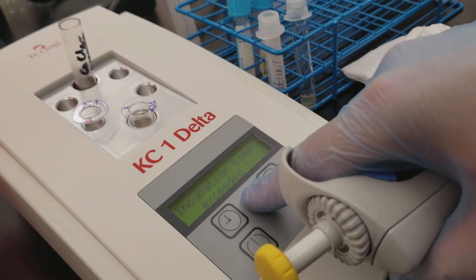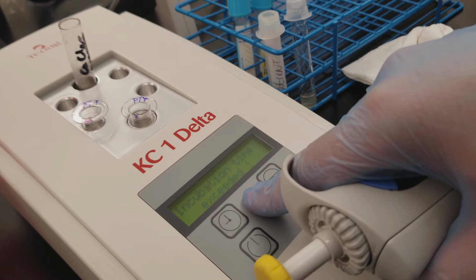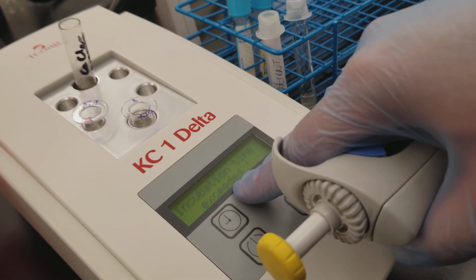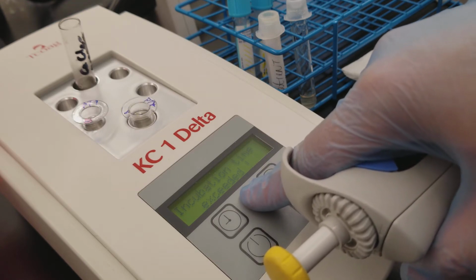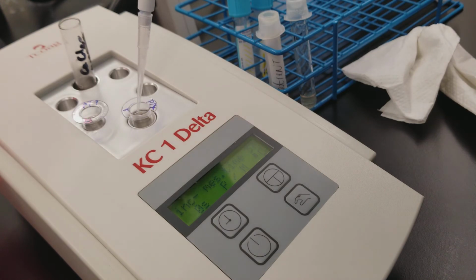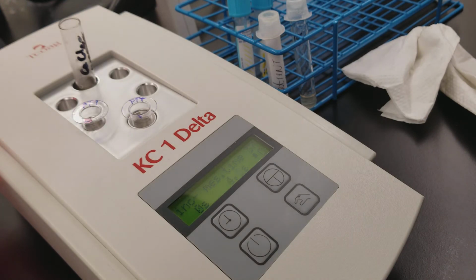Just because it says that the incubation time is exceeded doesn't mean that anything's wrong. Again, it's just looking out for you doing appropriate testing, and the time frame as well, because we're worried about the incubation time. So when we hit this incubation time exceeded window, that's okay. The next thing you would do is hit that power looking button thing, and that's going to start the clock once you hit this. So I'm sorry, I did that so quickly and I kind of said the wrong thing.